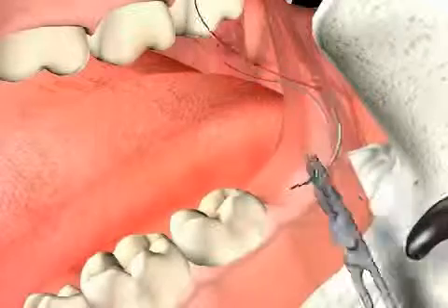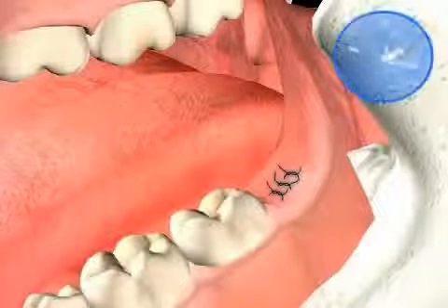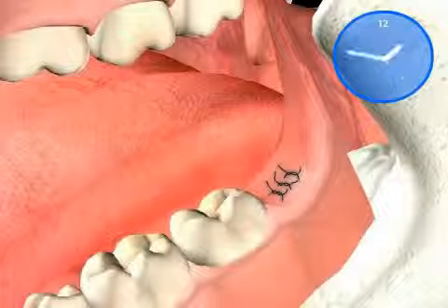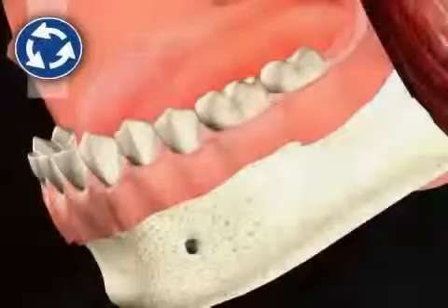Finally, a saliva-tight wound closure is performed, and in most cases, an iodine strip is placed into the wound and removed the next day. As a rule, the swelling increases until the 3rd or 4th day, and then everything subsides. A week after surgery, the threads are usually removed.